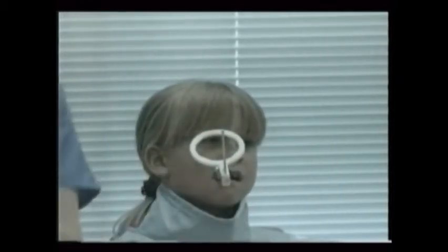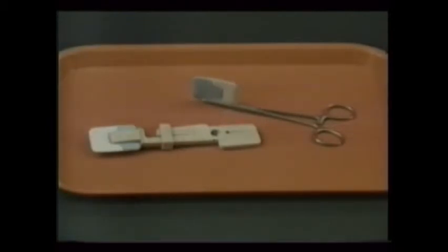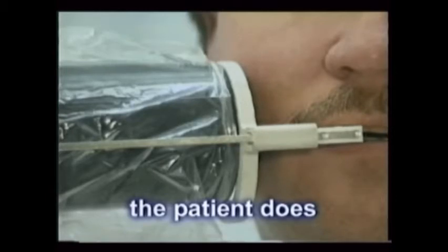Proper X-ray exposure demands exacting techniques. Retakes are not acceptable substitutes for proper technique. In order to ensure capturing a diagnostic image on film, film holders are used. It is not acceptable for you to hold a film in any patient's mouth during an X-ray exposure, and you should also not ask a patient to do it. Their untrained hand is prone to error, which can result in missed films and retakes. And who suffers? The patient.